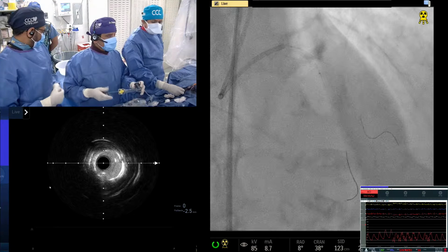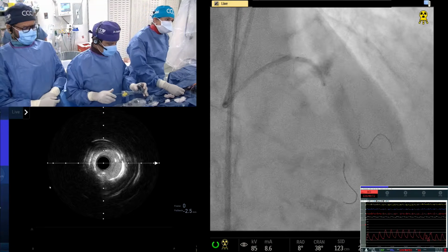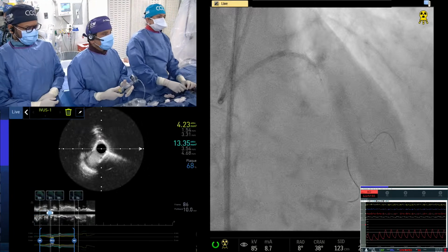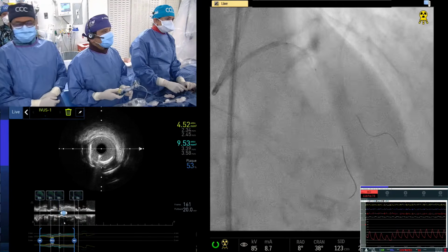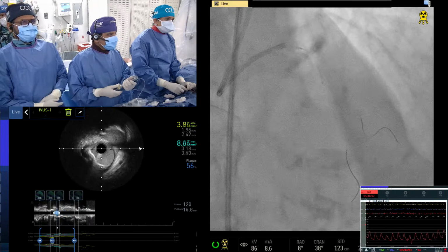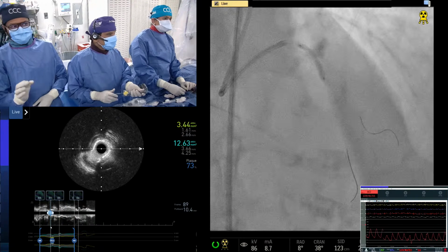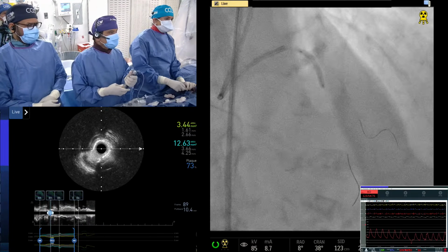Maybe even, we never saw a nodule before. I don't think it is protruding too much. It's a 360 calcium plate, a calcium sheet. Some part is eccentric. Let me go up again. Okay, careful. You were very close to that bridge.